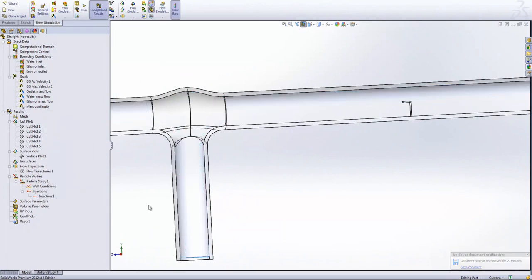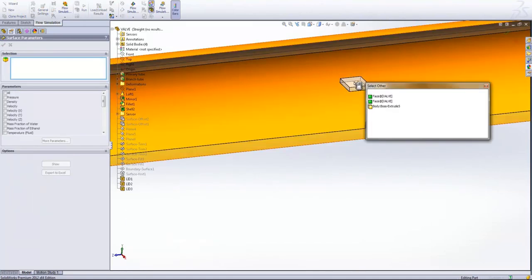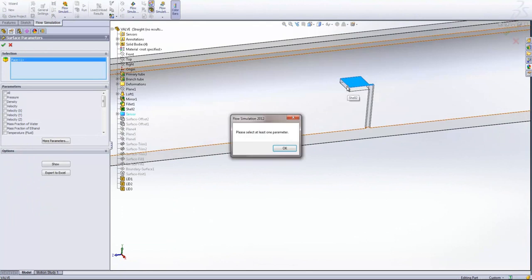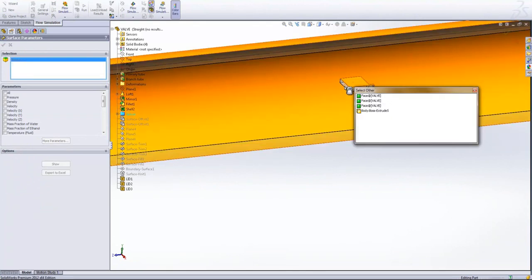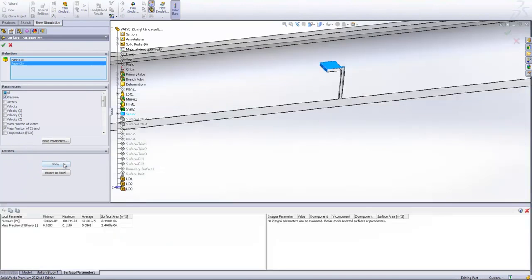So let's hide that. Next we can use the surface parameters, and we can grab, say for example, I'm just going to select a couple of faces on the sensor here. So I'm going to grab the top and the front face there, and we're going to have a look at the pressure and perhaps the mass fraction of ethanol on that sensor. So if I click show, what the system's going to do is calculate the minimum, maximum and average mass fraction values on that sensor surface, and also the pressure. So that pressure we might be able to use in order to work out what forces are acting on the system.